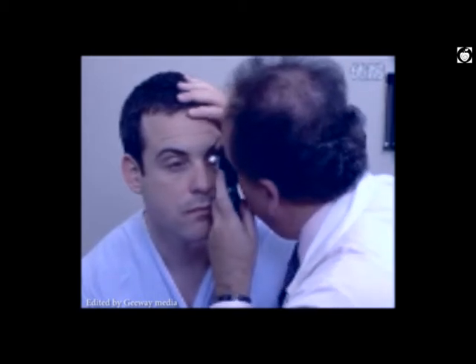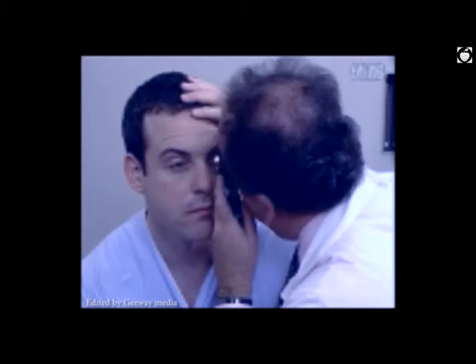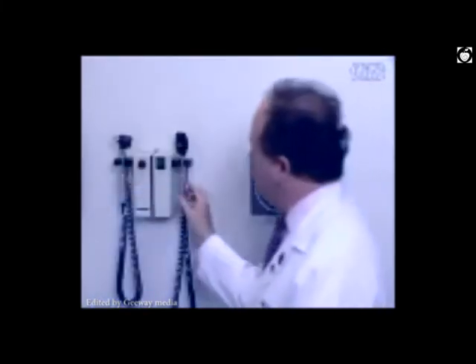Looking superior nasal, inferior temporal, superior temporal. And Mr. Johnson, look at the light, please. Thank you. This is the wall-mounted ophthalmoscope, and its operation is quite identical to the handheld unit.